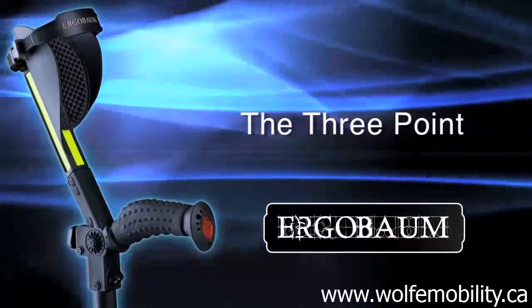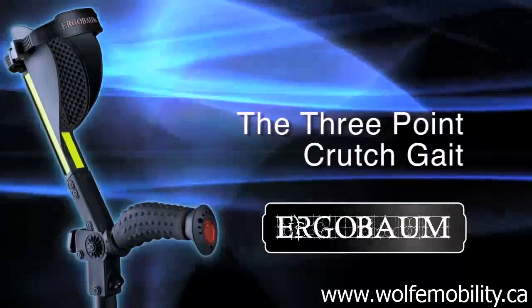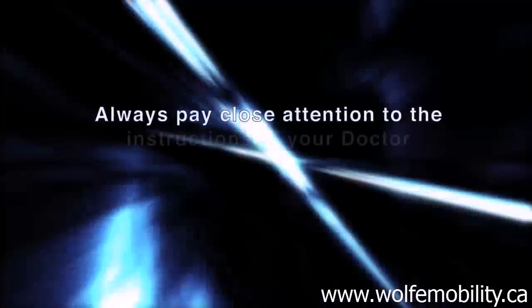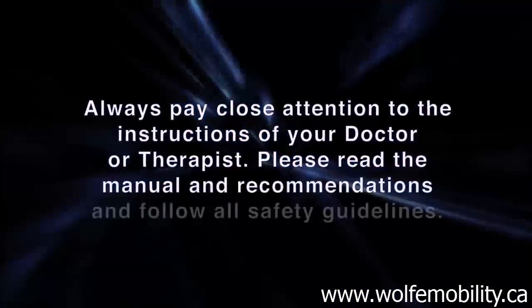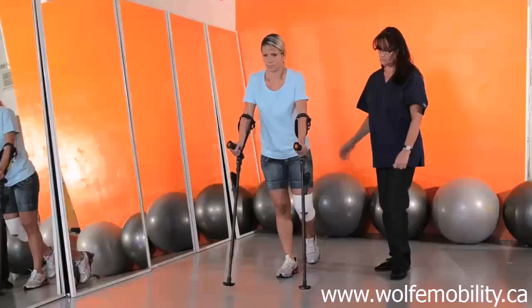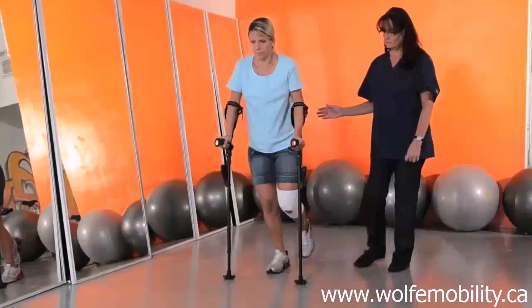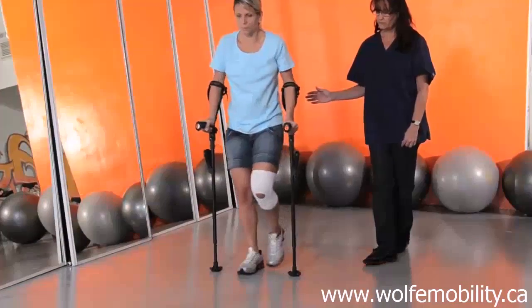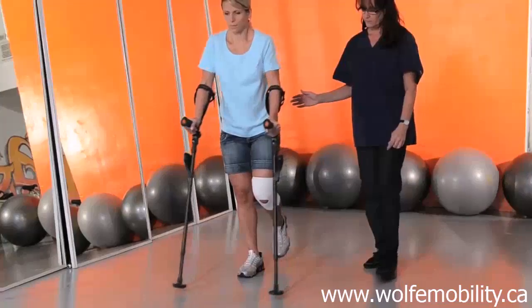The three-point crutch gait. This type of gait is used where there is incapacity to force weight or pressure under one of the lower extremities, i.e., bone fracture, injury, and/or amputation.